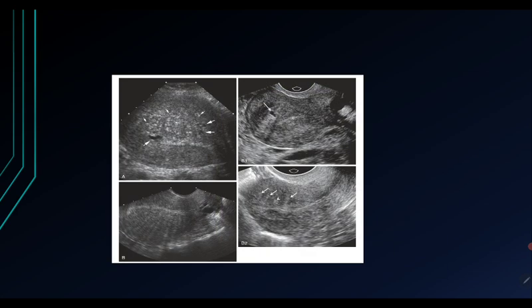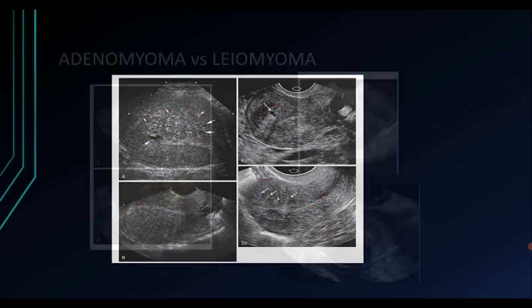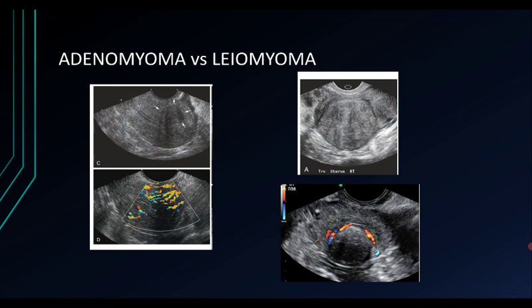You can see here the adenomyosis. This is the thickened endomyometrial junction. This is the Venetian blind appearance. This is a myometrial cyst, and these are myometrial striations. It can be myoma versus adenomyosis, but there is translesional vascularity here.